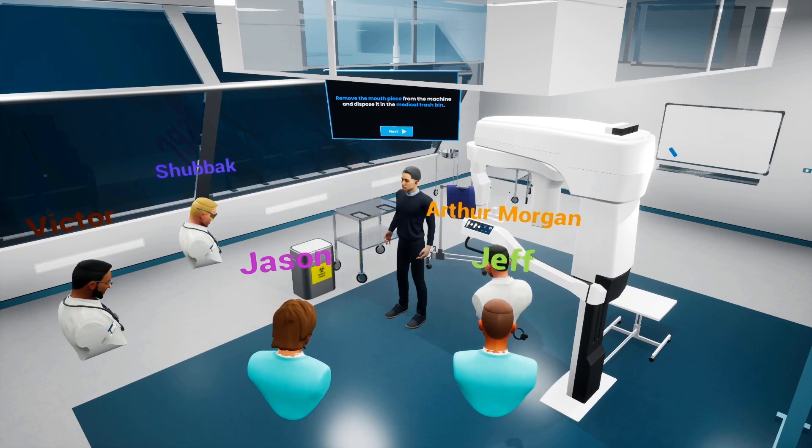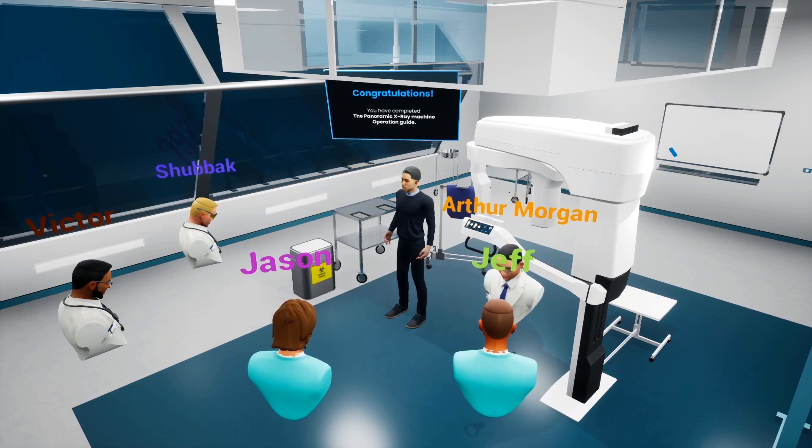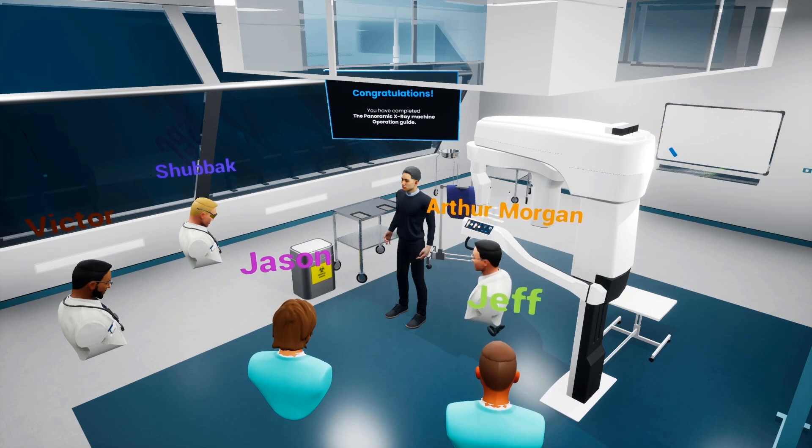We have just gone through the procedure of taking a dental panoramic image using an x-ray machine successfully. I hope it has been clear and informative. Thank you all.